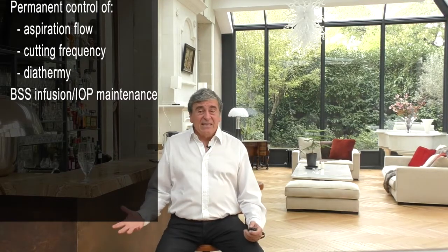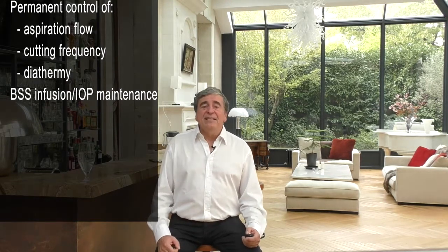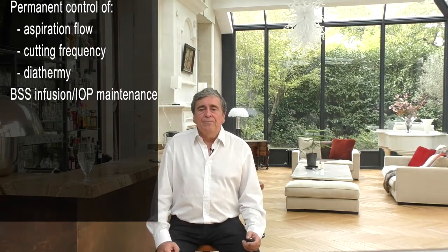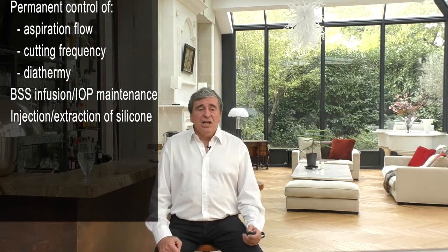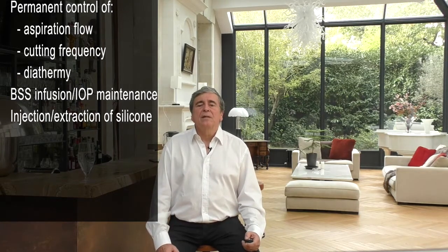We need a BSS infusion system to compensate for the aspirated fluids and maintain the desired IOP, and a system for injection and extraction of silicone or other fluids.